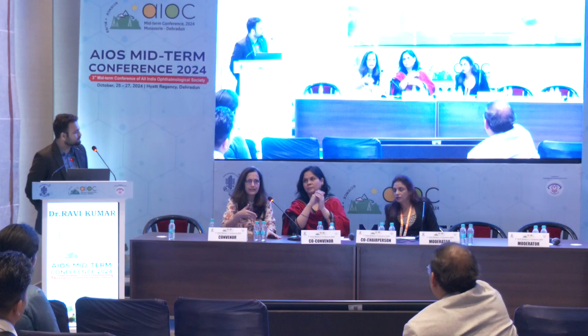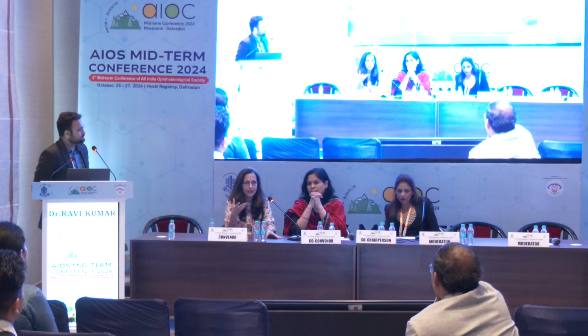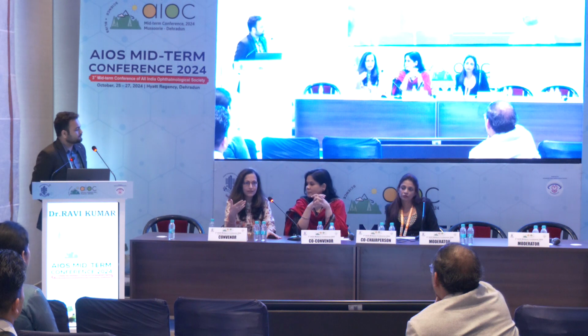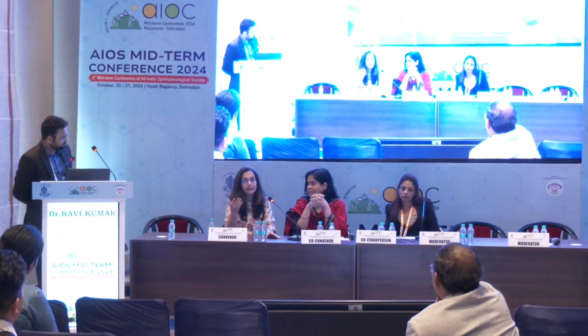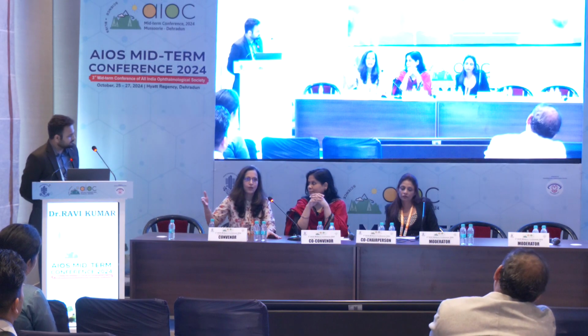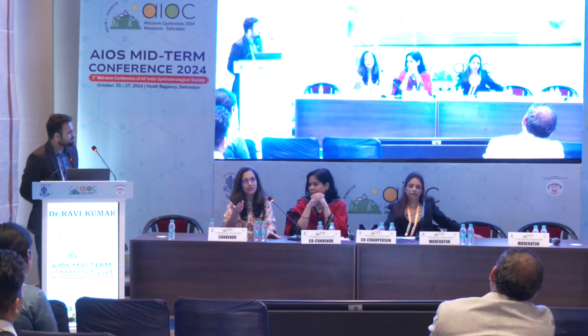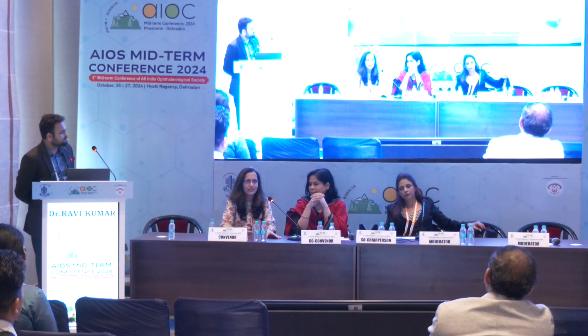So it is still at that stage where we can have documentation when we are following up a glaucoma suspect to understand whether these patients are actually developing glaucoma. As our resolution and imaging techniques are improving, we are able to detect much more changes, many of which may be false positives also. I have my serious doubts, but I think this is the way forward, where we can look in hindsight at whether these patients are developing glaucoma and these patients are staying normal. That is how we will have our imaging biomarkers which can detect glaucoma much earlier than when we see RNFL changes and GCC changes.